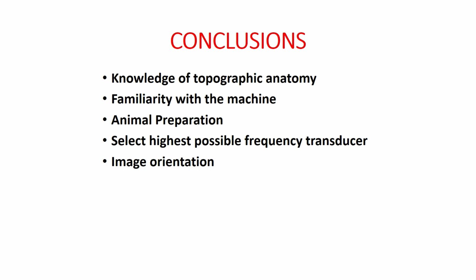Animal preparation is also mandatory before performing ultrasonography. Select the highest possible frequency transducer for abdominal ultrasonography as well as in large animal ultrasonography. So, these are certain conclusions regarding the basics of ultrasonography.